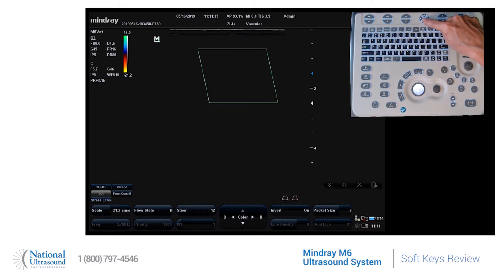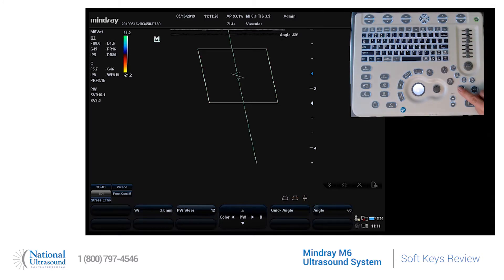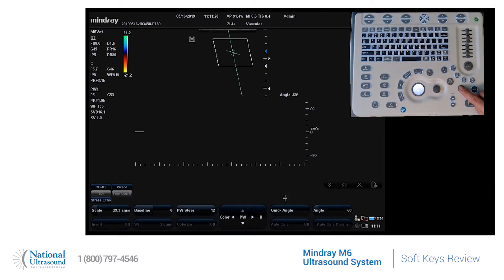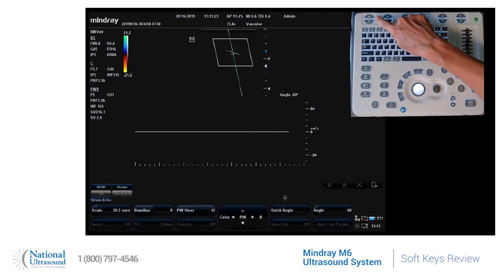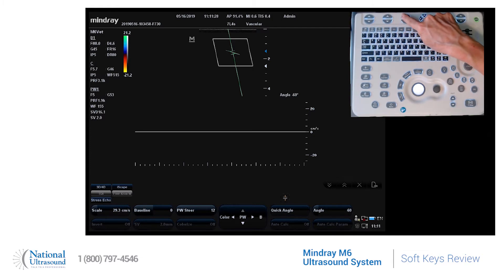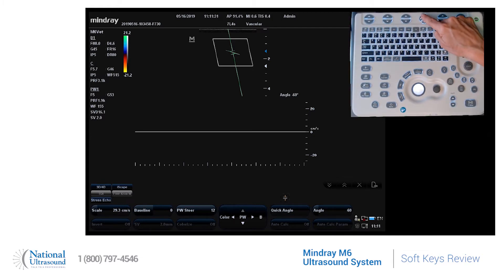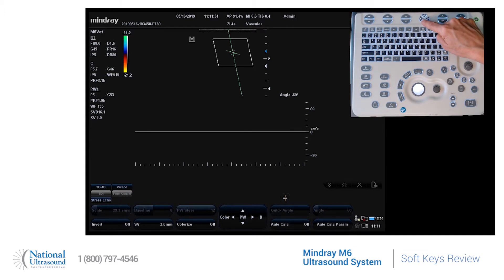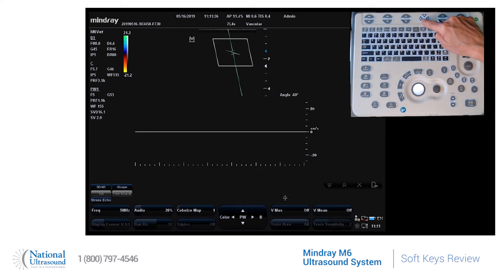If I now enter PW Doppler, you can see they are PW parameters like scale, baseline, steering, and quick angle. If I press the down arrow, I will get more options in PW Doppler.